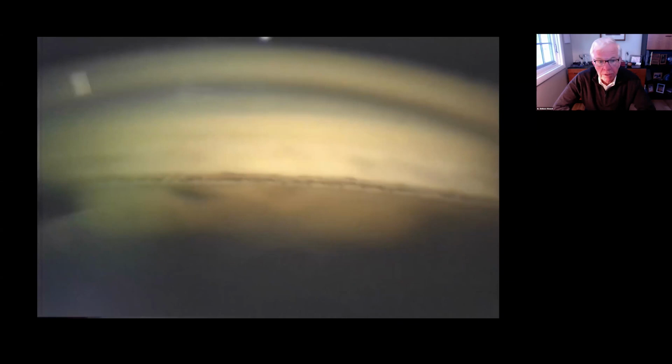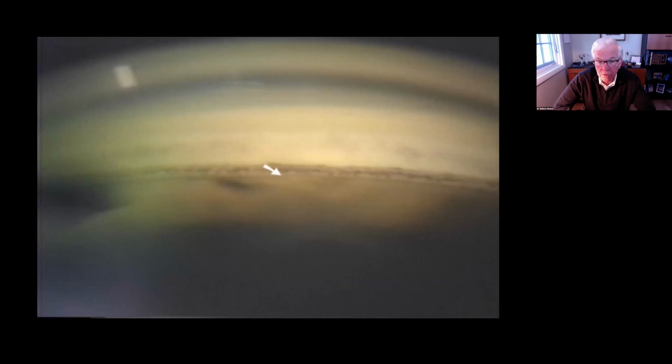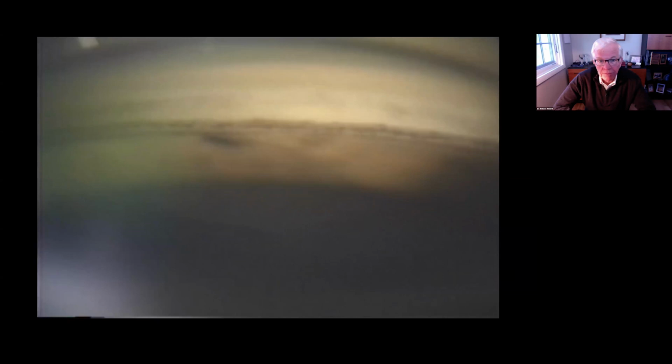I like this video. This is an angle that doesn't look that bad, you know? So I would say that looks like meshwork, scleral spur. I'm going to do laser trabeculoplasty, blast along here. But when I indent this eye, that was not the trabecular meshwork, right? That was a Sampaolesi line. That's what I thought was meshwork and spur. That's actually trabecular meshwork there and scleral spur there. So I would have just welded the angle together if I hadn't done indentation and determined where the actual trabecular meshwork was.